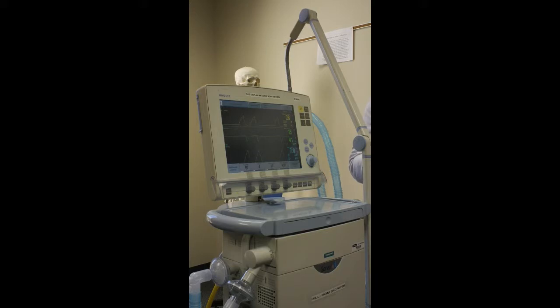Okay? So at the top of any vent sheet, you're going to have a place for your patient's name, maybe their MRN number, the time, what kind of ventilator, their ET tube size, and location. When you mark location on an ET tube, how do we know where it's at? Number at the lip, number at the teeth. Number at the teeth or gums if they don't have teeth.